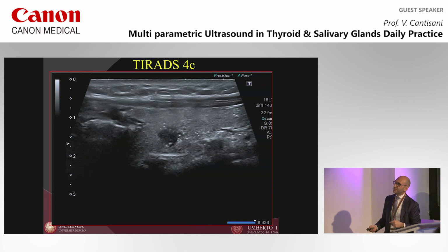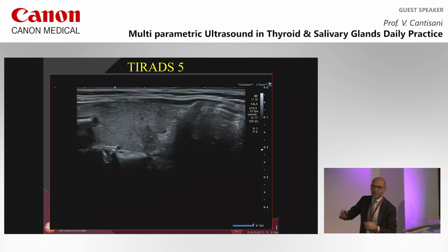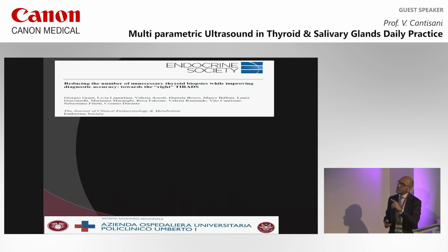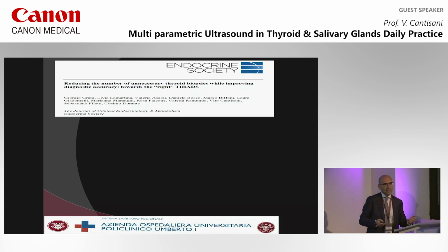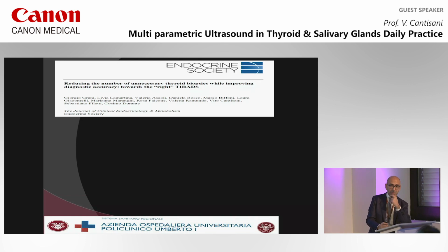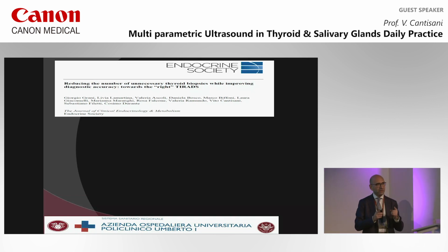This one and this one, taller, microcalcification, fairly marginated, hypoechoic. Okay. What we did was review them retrospectively with all the endocrinologist group in my university. I have the luck to have a very good endocrinologist. One of them published 3 papers in JAMA, 1 in the New England Journal, and now is really the one who follows to understand the natural history of the nodule.